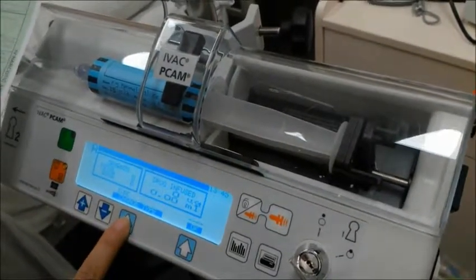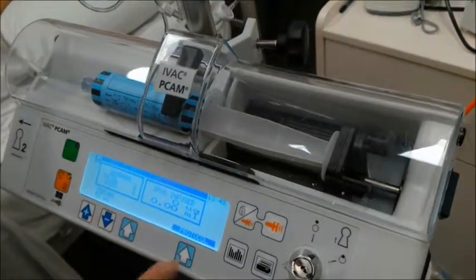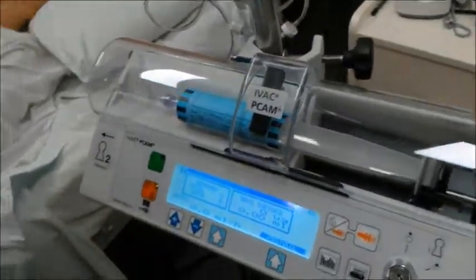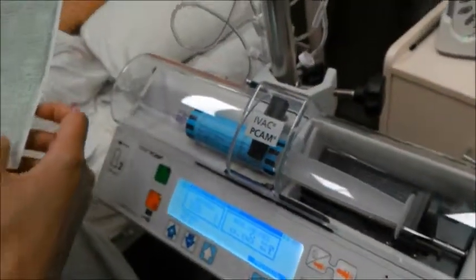Performance range. Okay. All right, my PCA is ready to begin. Here's my medication order.